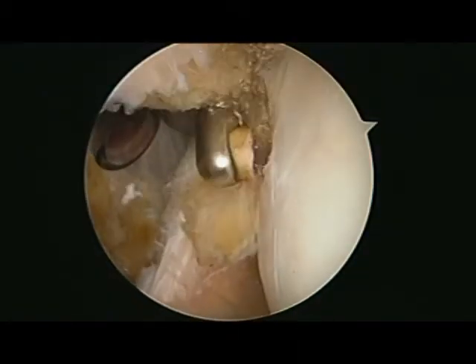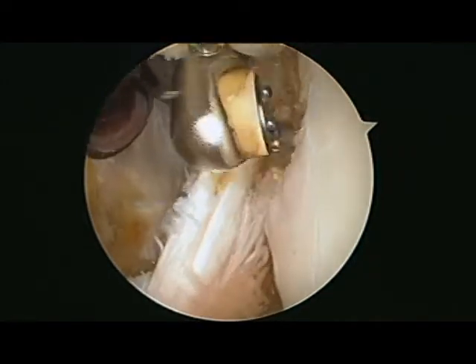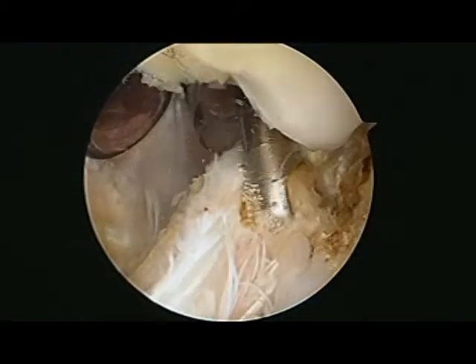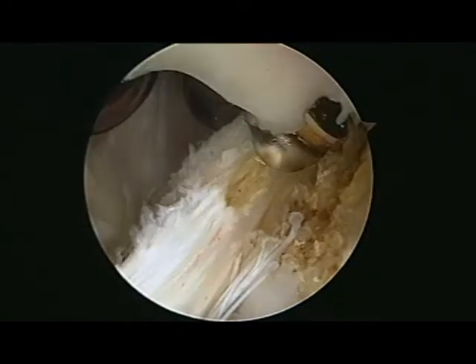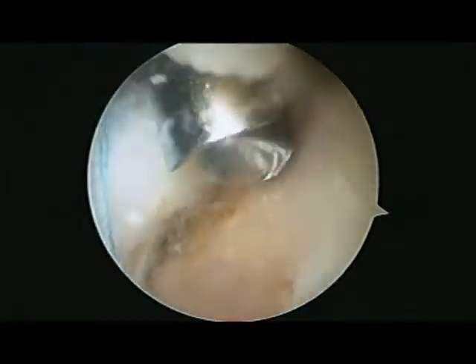The first step of repairing the subscapularis is to free up any scar tissue and to make a better bed for healing. This is called the lesser tuberosity, and I've got to get all that soft tissue off of the lesser tuberosity so that I can get the tendon to heal back. Next, I'll bring in this little burr or bone removal device and take the top layer of hard bone off — the idea is to improve the chances that the tendon is going to heal into that spot.